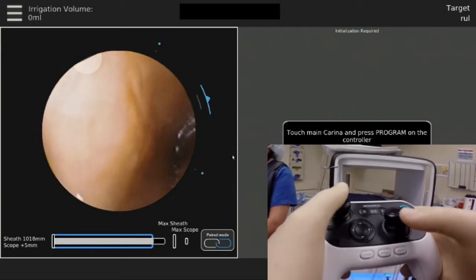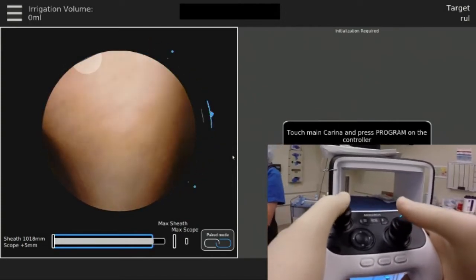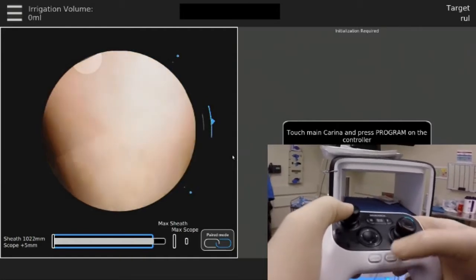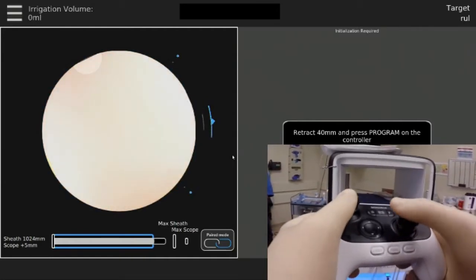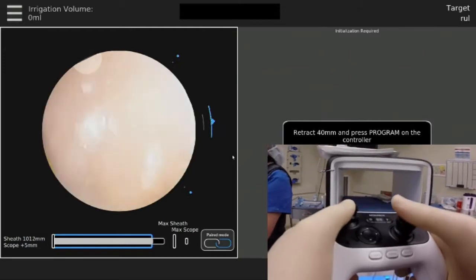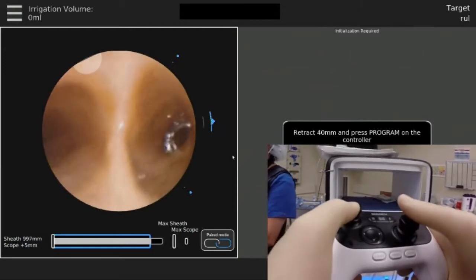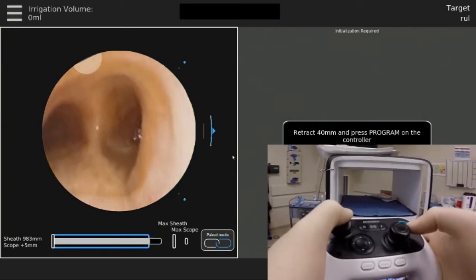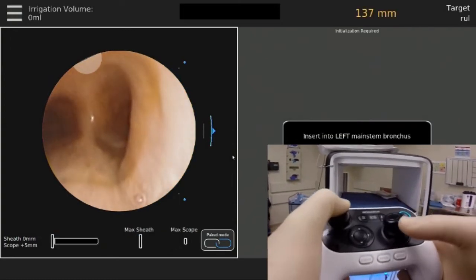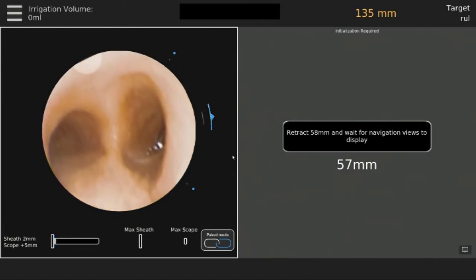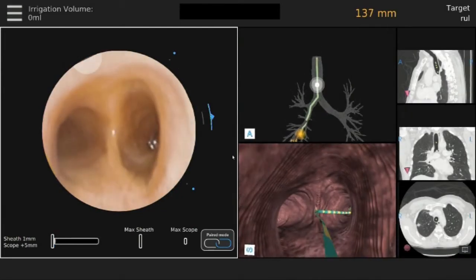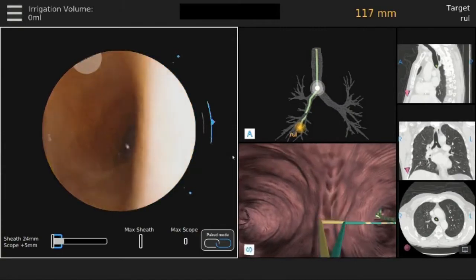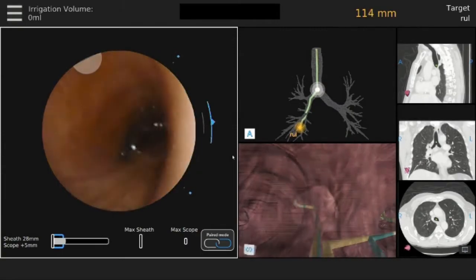Initialization involves a series of steps. The first is ensuring the proper orientation of the tracheobronchial tree. The second step involves advancing the scope to the carina and then withdrawing the scope to a sufficient length to allow orientation with the tracheobronchial tree. When the virtual bronchoscopic view emerges on the screen, initialization is complete.